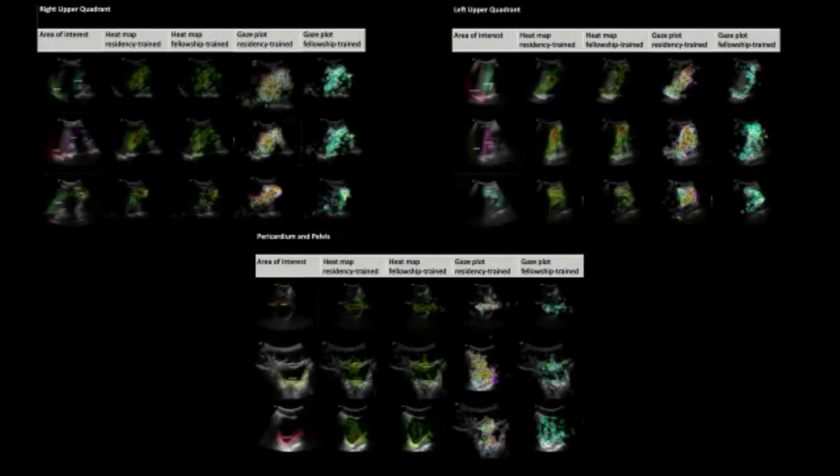And so what they identified is some standardized zones, like what we saw in the previous study, R123, L123, things like that. They identified these standardized zones, and then they said, okay, we're going to put on these really cool glasses. I forget what glasses they were, basically some gaze detection glasses. And you're going to do this exam, and we're going to see where you're looking. We're going to see if you're hitting all the places we want you to hit, because we have this superpower where we can actually see where you're looking. So you can't just say, oh, yeah, of course I look there. We can actually know now as the educators, right? So they put these gaze fixation glasses on.